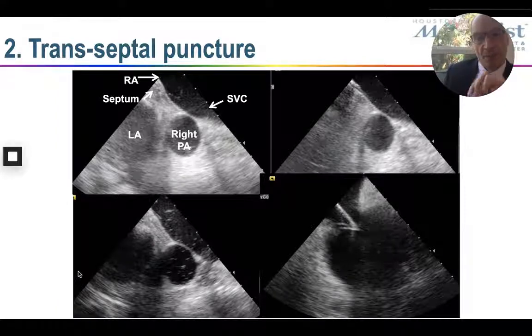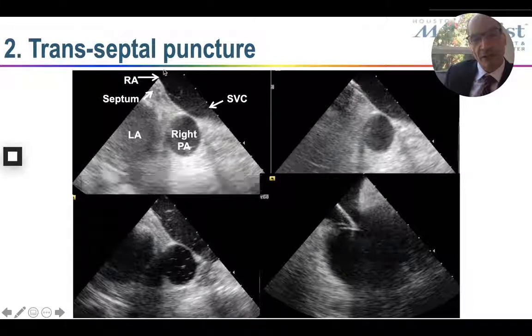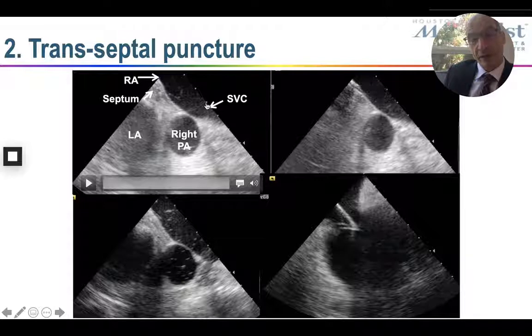Next is the transseptal puncture. And I love this view where you go up to the SVC-RA junction with the transducer, and you can see the anatomy is very clear. Superior vena cava, this is the septum as the superior vena cava joins the right atrium. Behind the septum, there's the left atrial body, and on top of it, between the SVC and the left atrium, you have the right pulmonary artery.